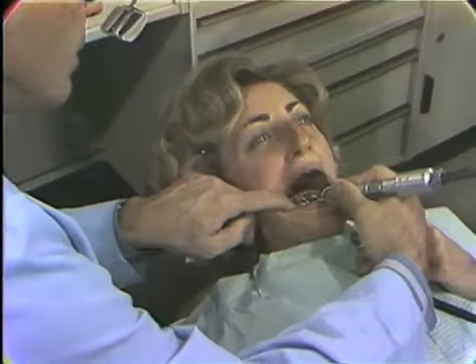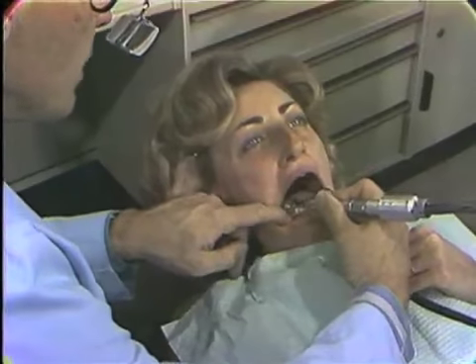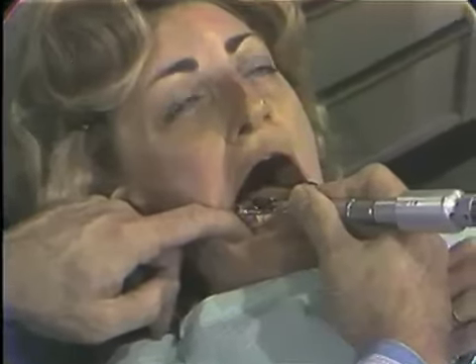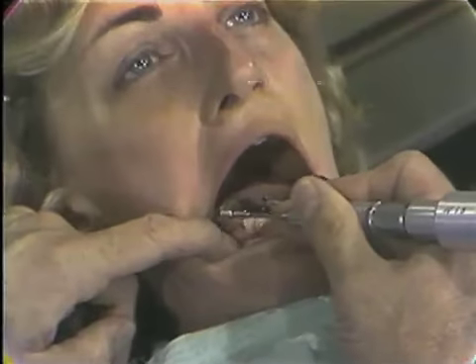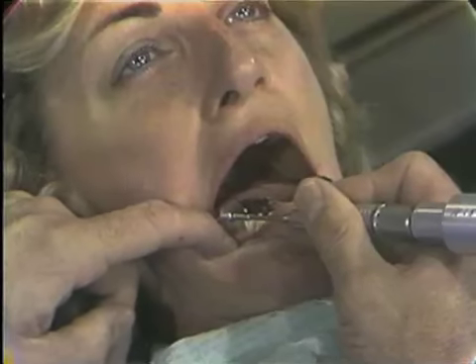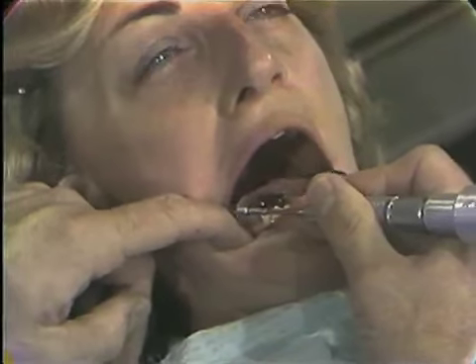So we will now show, we would slice the lingual and we can slice the buccal. Notice my finger. That finger, if this should catch, and we hope it won't, and it doesn't very often, but if it does catch and it tunks into your finger, suddenly your foot will stop and you won't keep on drilling. This is one of the reasons that we like to use this instead of a mirror.